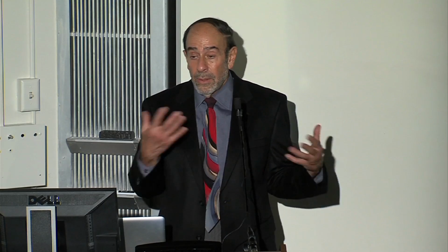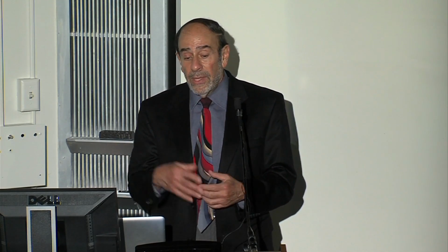There are a number of companies that make software for that. I happen to be a medical consultant to one that doesn't actually sell it to anybody. They license it to other companies like GE or somebody like that, and they use that. But I'm a consultant to them and help them develop that and figure out applications for it, as well as what looks good, what doesn't look good, what might be a better technique. But the companies that actually make it and sell it, we have multiple different companies, different vendors here, and their software and hardware.